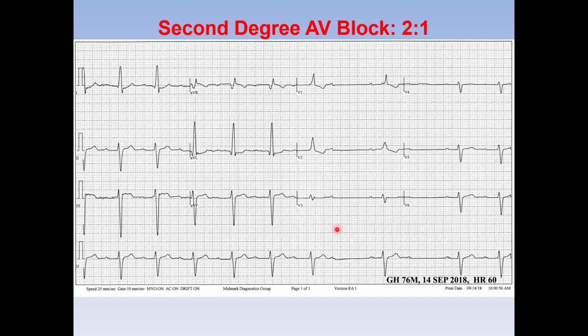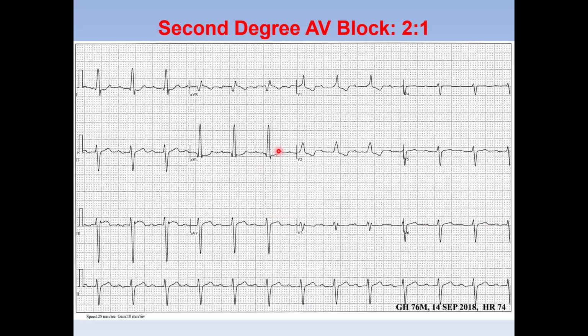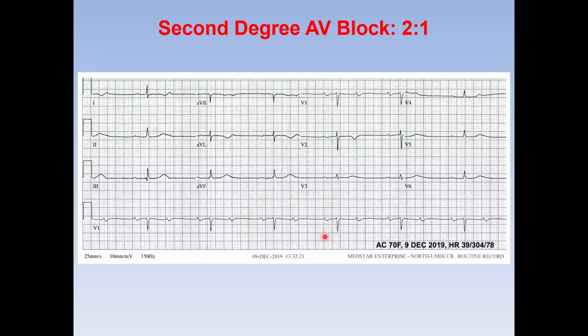And that's the part when students sit in the exam and we want a specific answer. Sometimes we have to accept not so specific answers. So if a student tells me that this is Mobitz type 2 second degree AV block versus 2 to 1 AV block, I'll accept both of those answers as correct, unless I get into a discussion with that person about where the location of the block is. Is it supra-His, infra-His, is it a narrow QRS, longer PR interval. It's interesting that infra-His block most of the time has a shorter PR interval compared to supra-His block. Tushar, any comment on that, or you're fine with this?